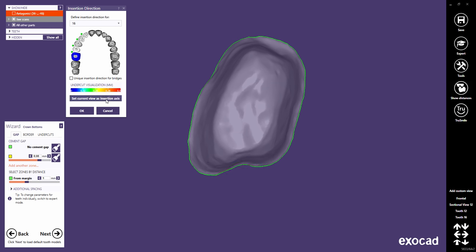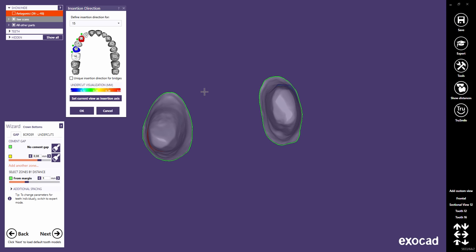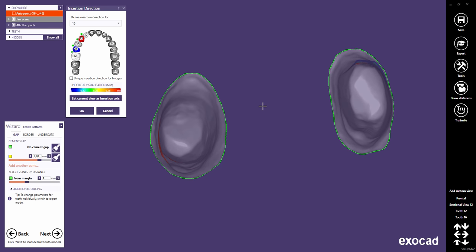Use the drop-down menu to switch to another tooth and correct its insertion axis. In the tooth bow, you can select a series of teeth with a click to define a unique insertion axis for those. Click 'Set Current View as Insertion Axis' to define a unique insertion axis for the selected teeth.